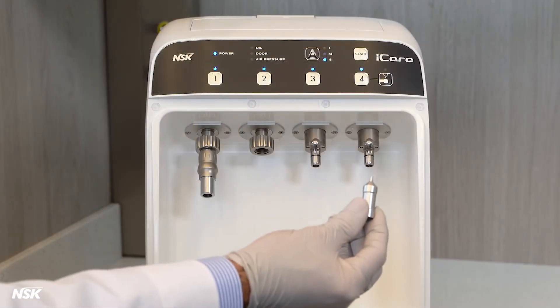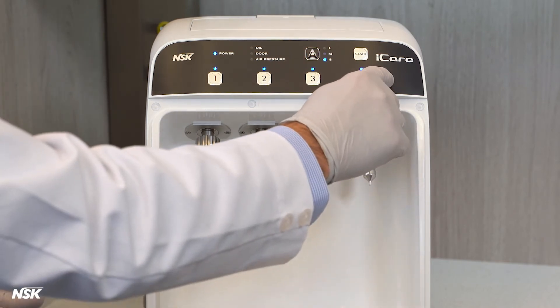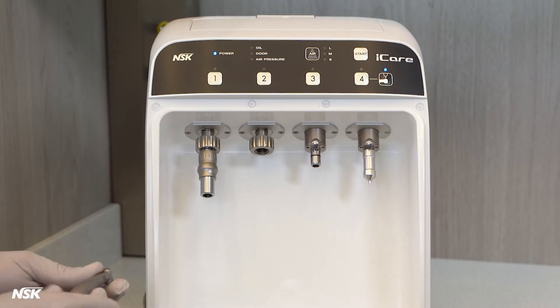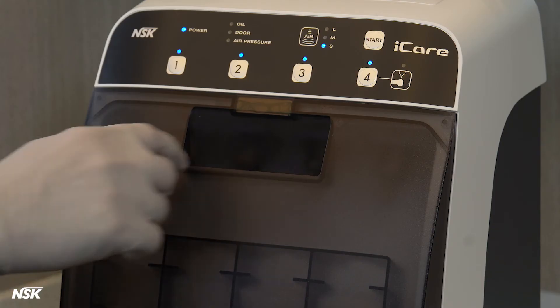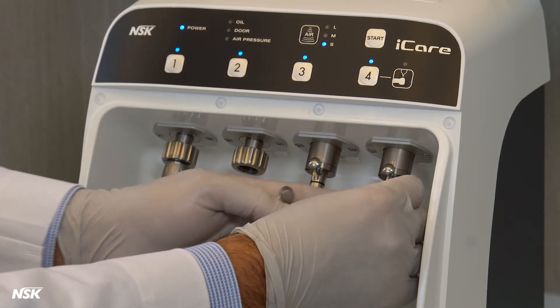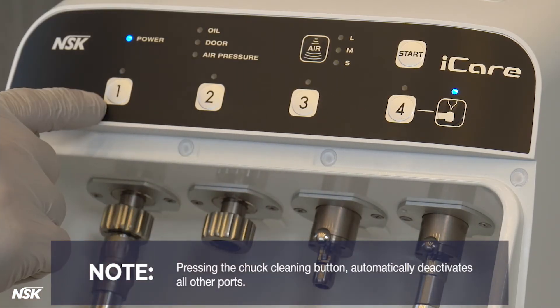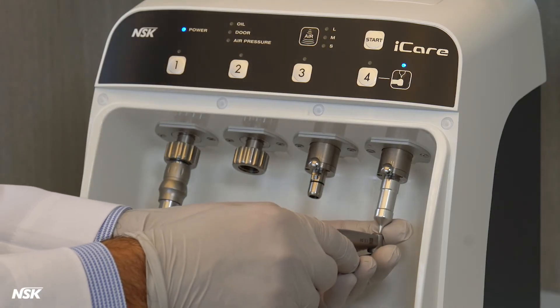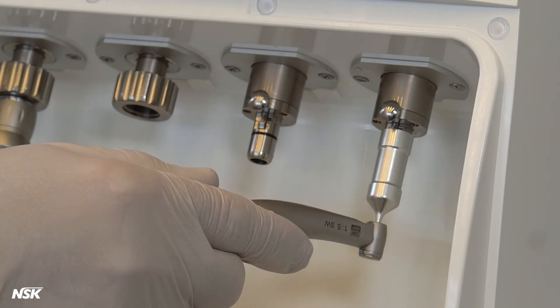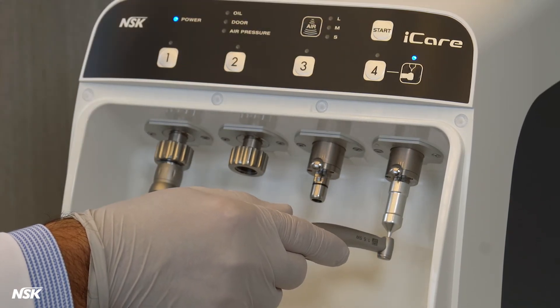Cleaning the chuck is essential, especially for high-speed air or electric handpieces. This step prevents your burrs from getting stuck in the handpiece or your bur running out. To demonstrate chuck cleaning, we use port number four and this special chuck cleaning nozzle. With the Eye Care door open, insert the chuck cleaning nozzle into port number four until it locks in with a click. Press the chuck cleaning button — note, this automatically deactivates all other ports. Hold the handpiece so the tip of the nozzle is inserted into the burr insertion hole of the handpiece. It's important to hold the handpiece firmly as oil will be purged into it. Press the start button to begin the chuck cleaning process, which should only take four to five seconds.